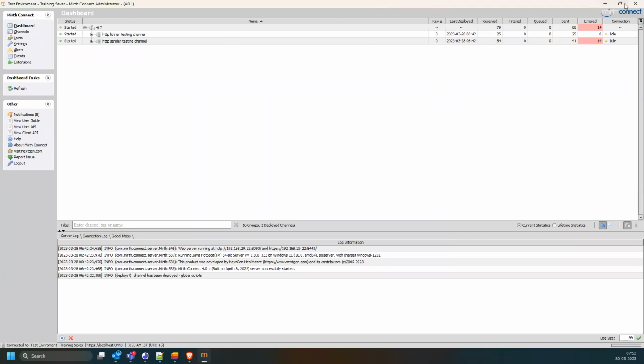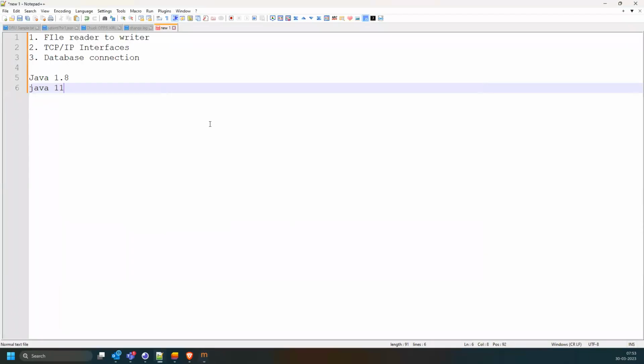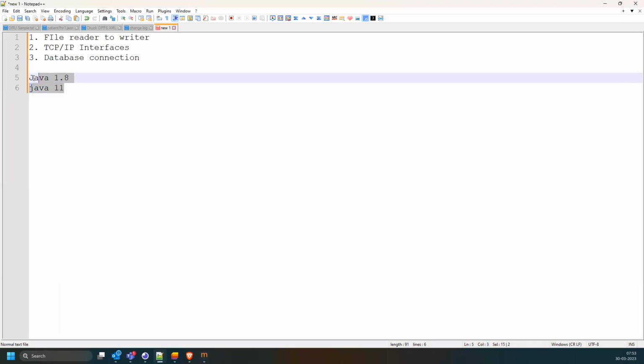This is the same process that you have to follow. If few of you might have challenges, don't worry. In tomorrow's session, we are going to spend time and troubleshoot any issues that you have. My recommendation is it will take 15-20 minutes for you to complete the installation. Spend some time and make sure that before tomorrow's session, you are able to install Mirth Connect, so that we can troubleshoot any issues that you get and make sure that you have an instance running.